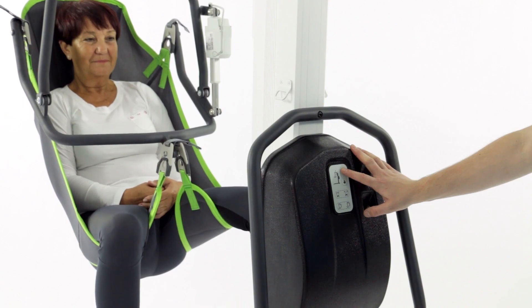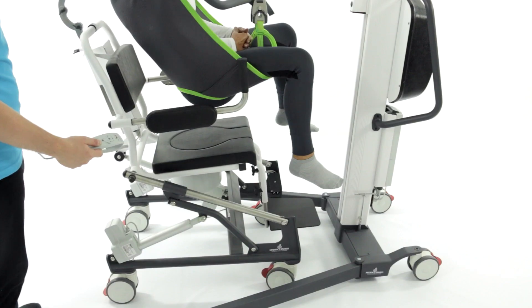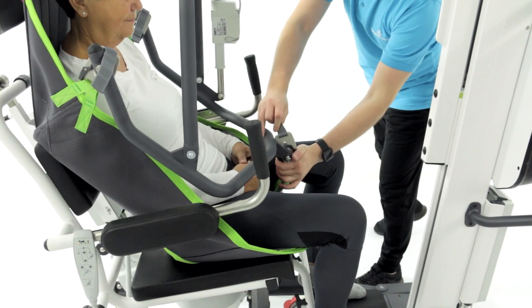It enables easy lifting of lying or sitting patients and safe transport of them in a comfortable position to the bathroom, toilet, bed, or wheelchair.